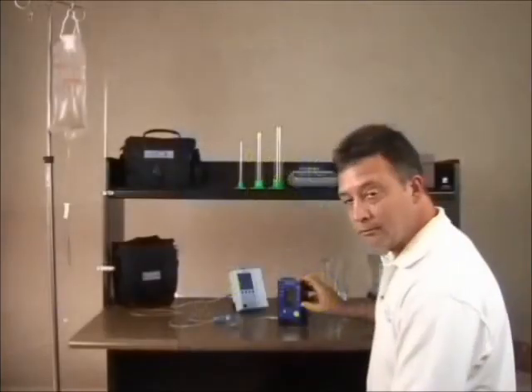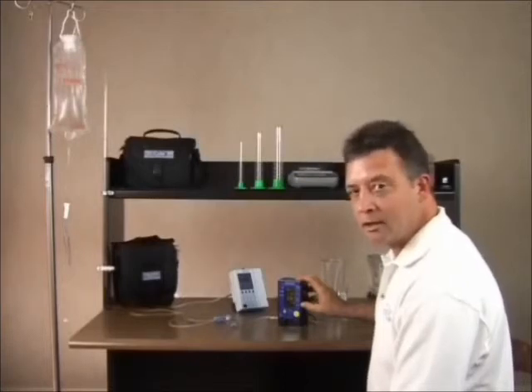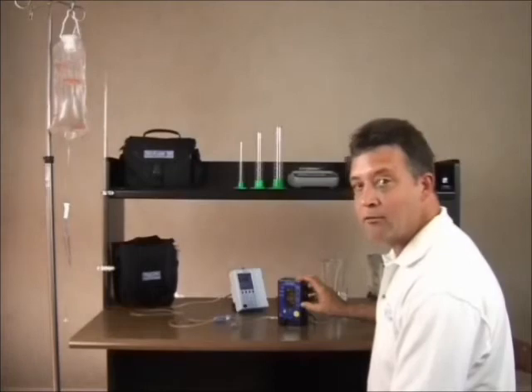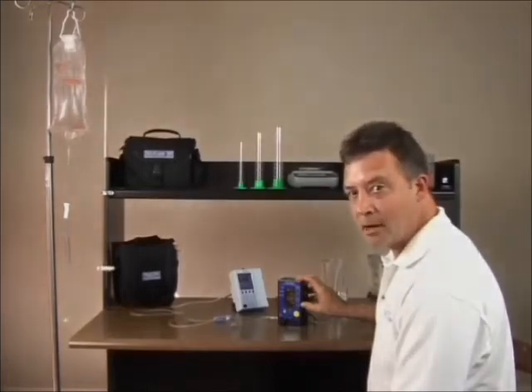Flowtrax is also capable of doing electronic record storage and download, as well as software upgrades via a USB port, and is very portable, and can operate on both AA batteries or AC power.